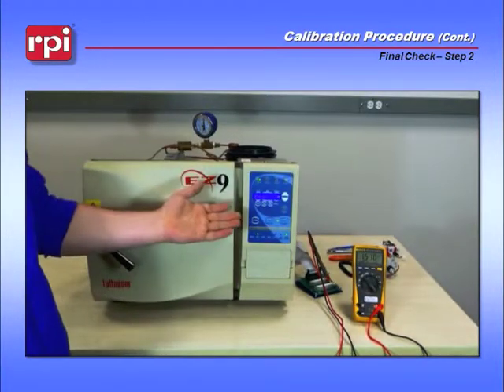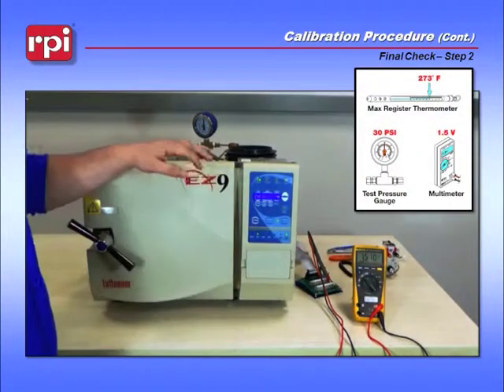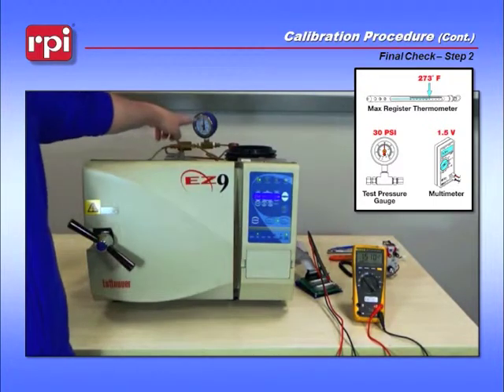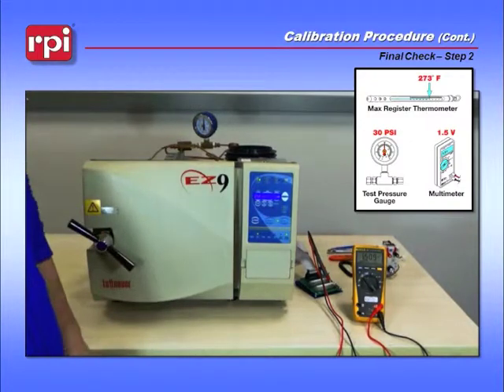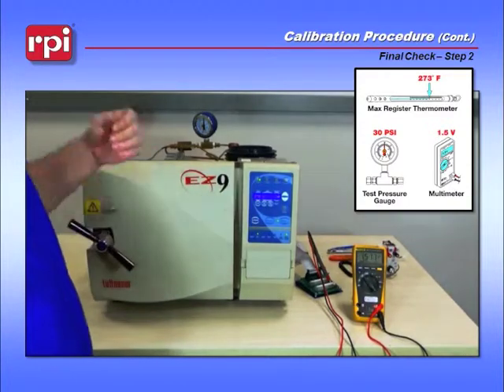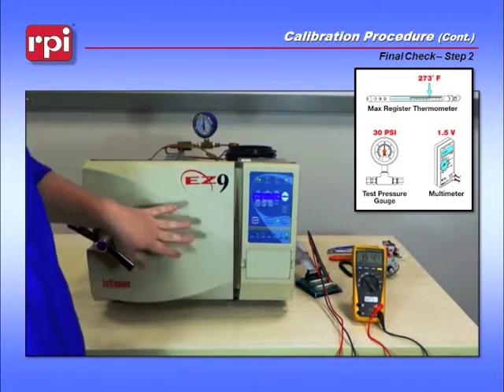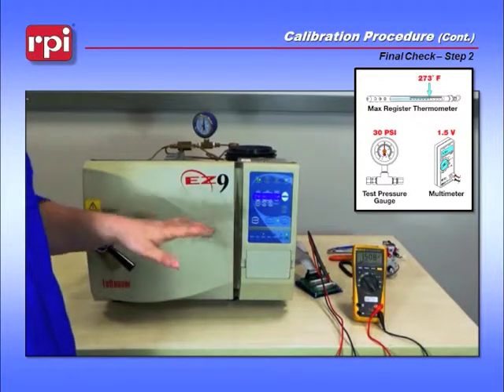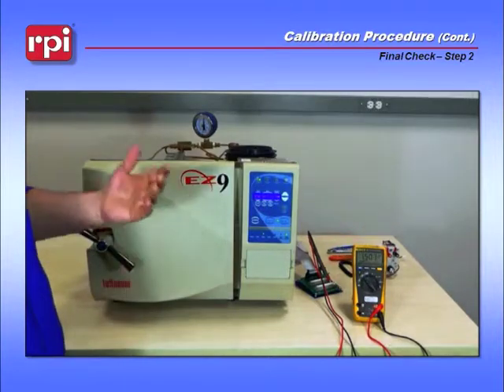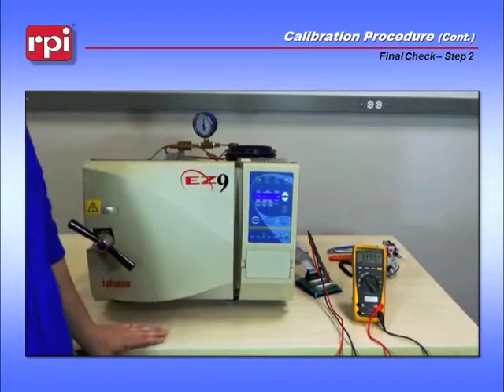Nearing the end of your cycle, you should see the 1.5 volts. The display is showing about 29, so we're a little on the low side, but the external pressure gauge is right at 30. Once you've vented, shut the machine down and let it cool a little bit. Pull your max register thermometer out from inside the chamber and verify that it reached the maximum temperature that your display showed. Disconnect your test equipment and test gauge — that completes the calibration.